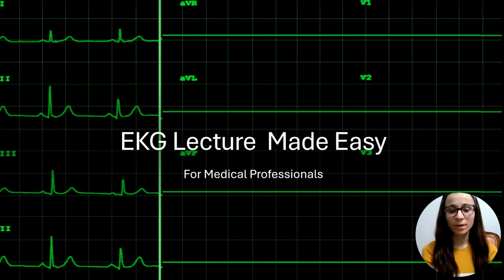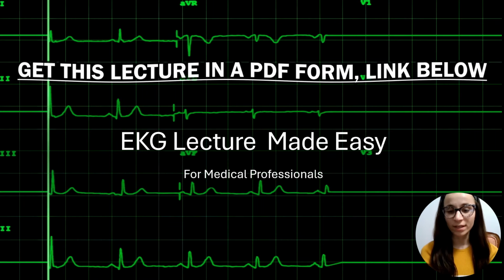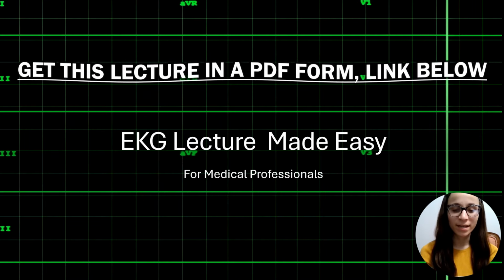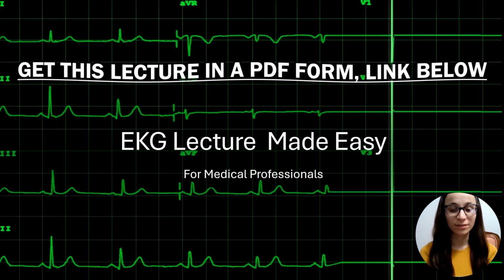In this video, I'm going to be going over EKGs. It's going to be really simple. You're going to be able to understand what's going on, and it's going to go over everything from bundle branch blocks to ST elevations to your simple rhythms. And the reason why I made this lecture is because EKGs is one of those things that a lot of people are not proficient in, and a misdiagnosis of something could really be the difference between life and death.